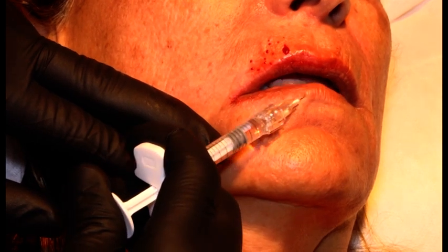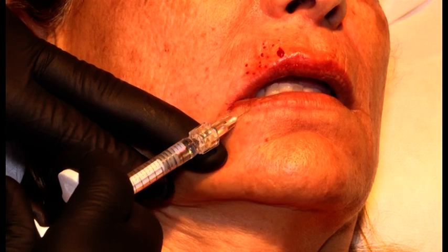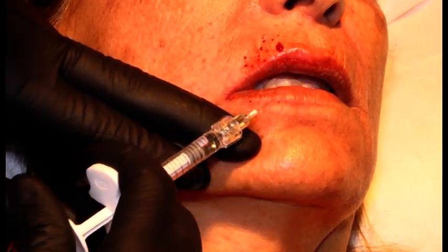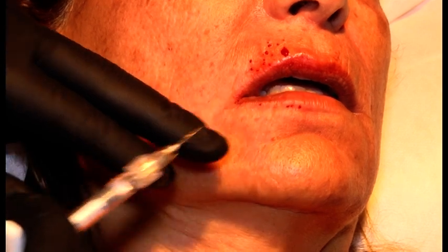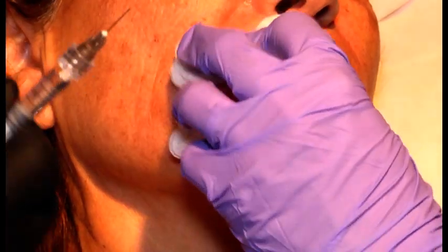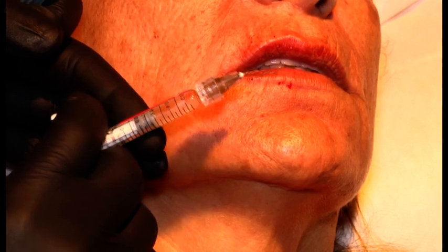So if you only inject Belotero Contour, you can use it in this way not only for vermilion border extension, like contouring the lip, but also for hydrating the lip, because this also gets into the cutaneous lip of the red lip. So this is Belotero Lips Shape, the dry red lip.